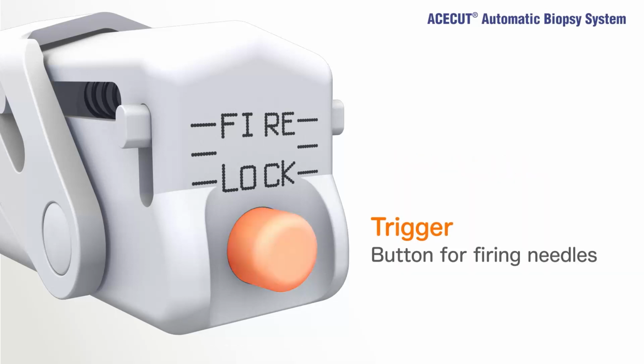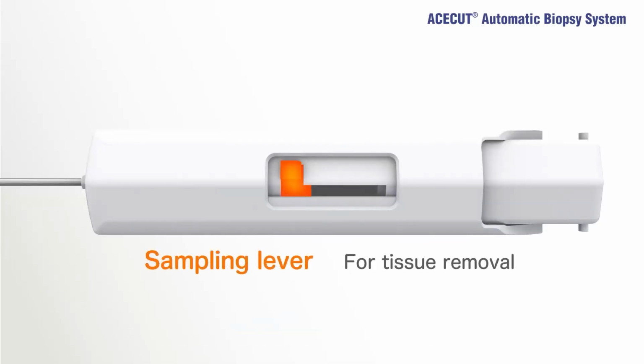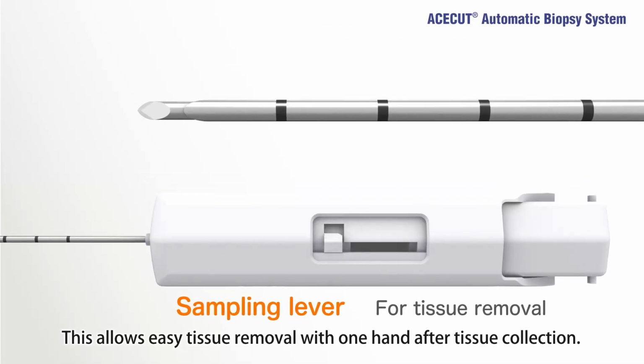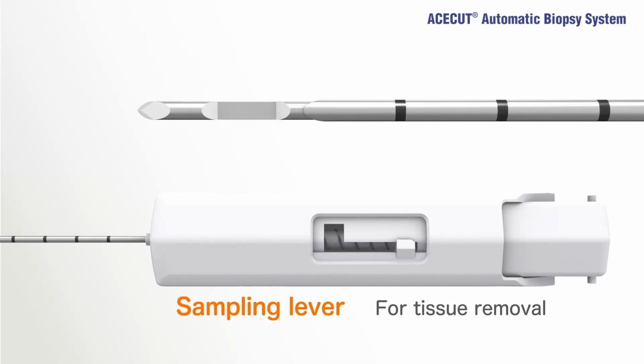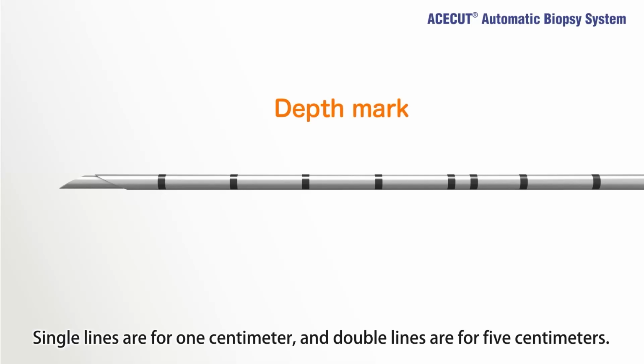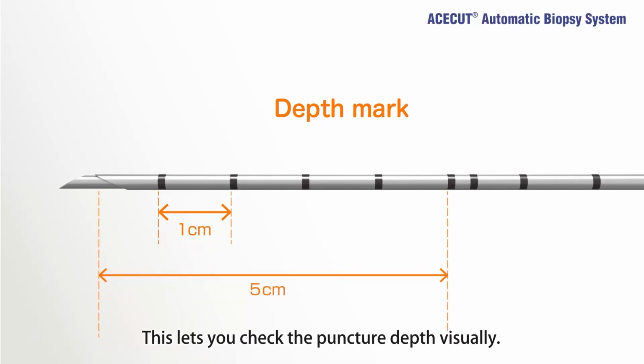The trigger. Push the trigger to fire the inner and outer needles. Sampling lever. This allows easy tissue removal with one hand after tissue collection. Depth marks. Single lines are for 1 centimeter, and double lines are for 5 centimeters. This lets you check the puncture depth visually.